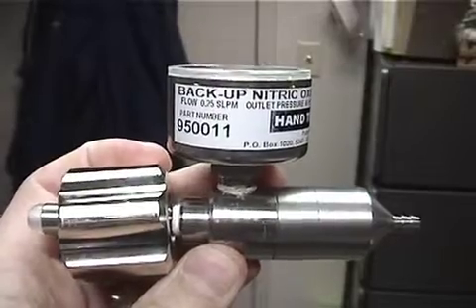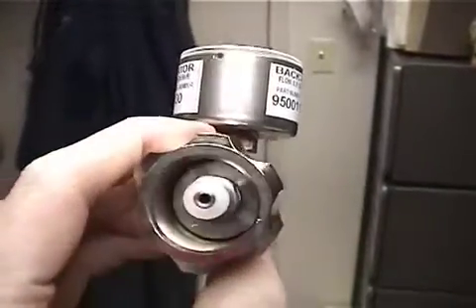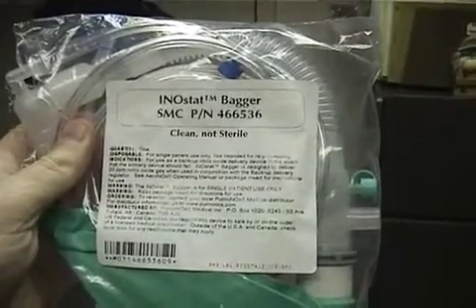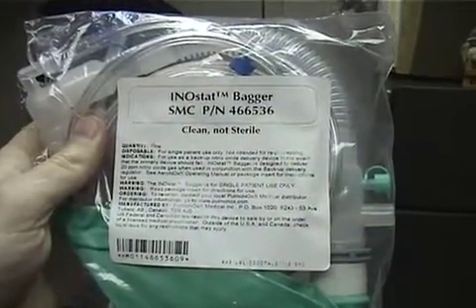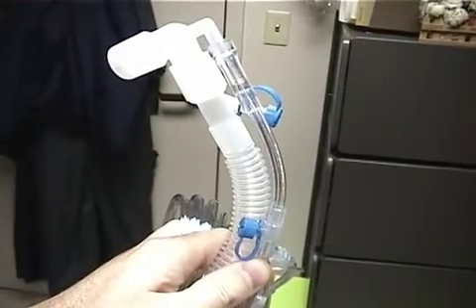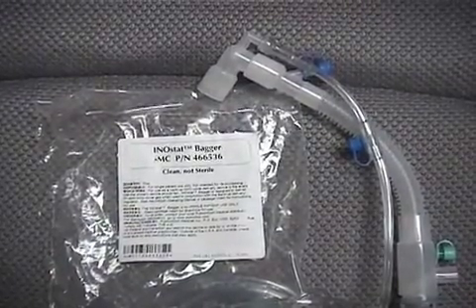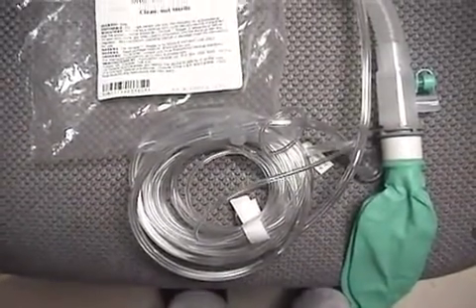The backup system consists of a backup regulator that delivers a set flow rate. It also consists of an INO bagger, which is a specially designed anesthesia resuscitator with additional ports. An additional line to this regulator is designed for the installation of the INO from the cylinder.